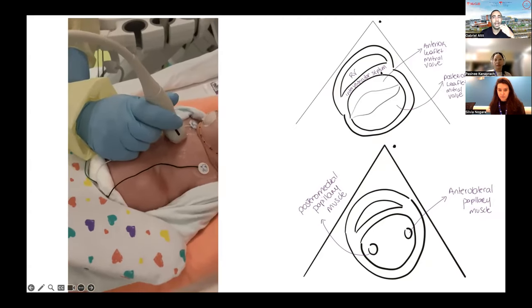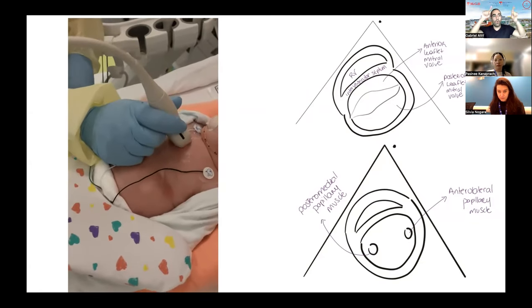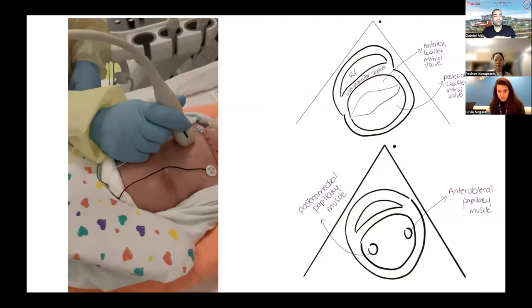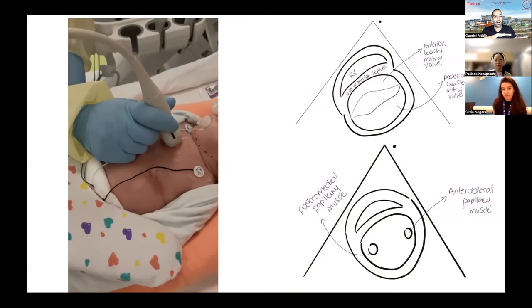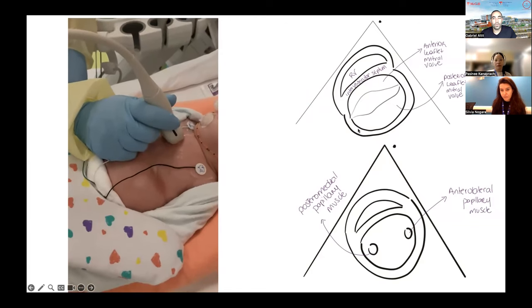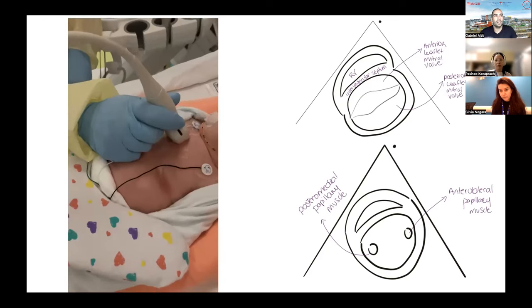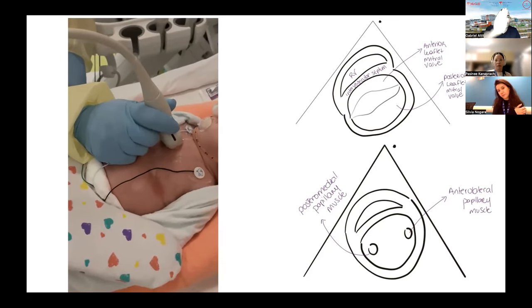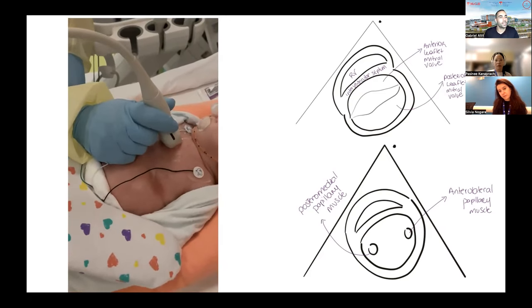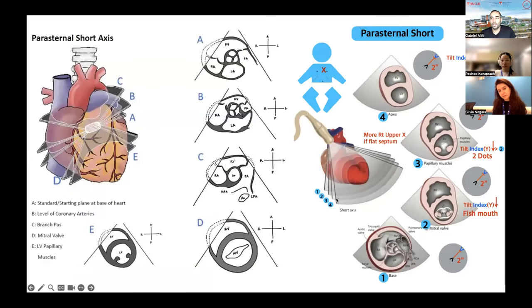It also provides you an assessment from top to bottom, from cranial to caudal, of the whole wall of the LV. So it's an excellent view to assess ventricular function from the level of the mitral valve to the apex. You can see, is my wall functioning well here? Is it functioning well here? Sometimes I hide portions of the screen as I re-look at my images to see whether certain portions are not working well. Like, is the apex not working well? Things like that.